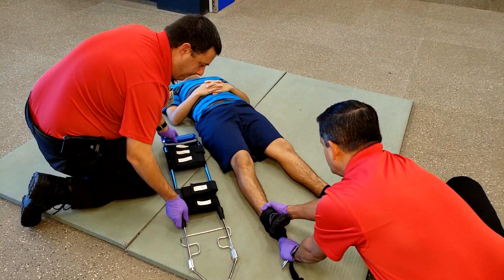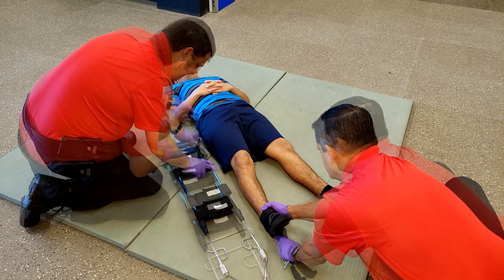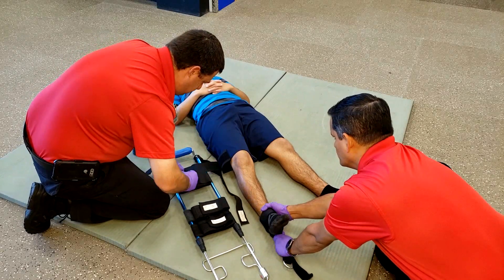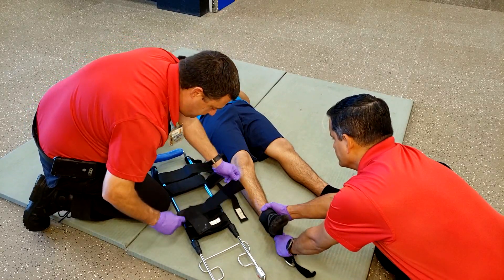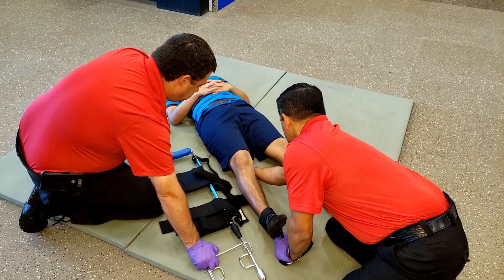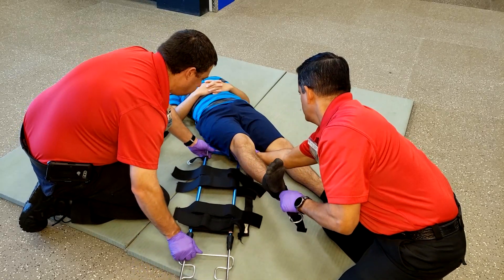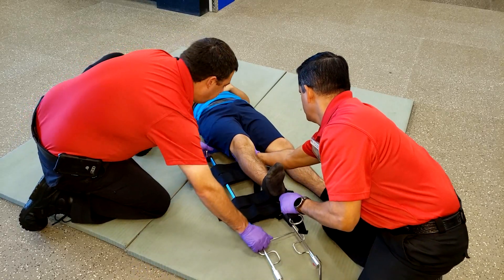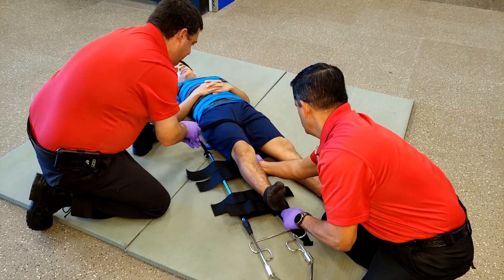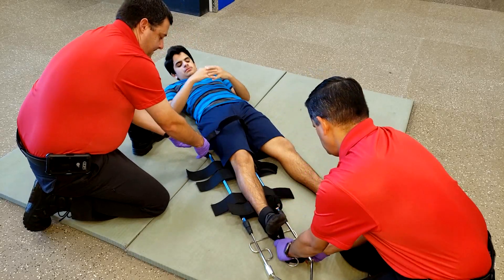It is recommended to never pass equipment over your patient. Prepare the traction splint to be applied by opening all the straps — the ischial strap and the four straps along the way. Have your partner continue manual traction while supporting and lifting the leg, then bring in the traction splint at an angle until it is under the patient's leg and slide it up towards the ischial tuberosity.